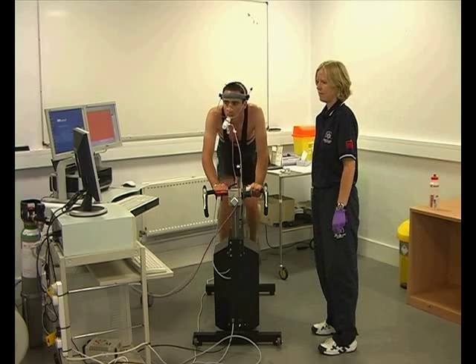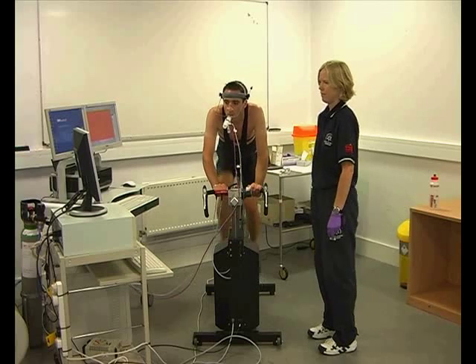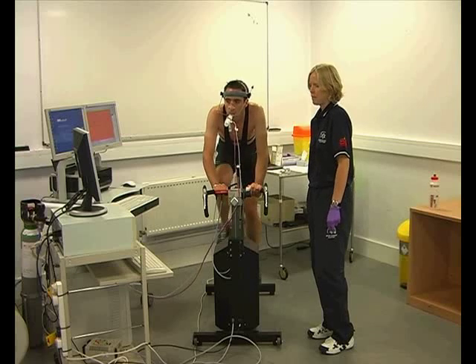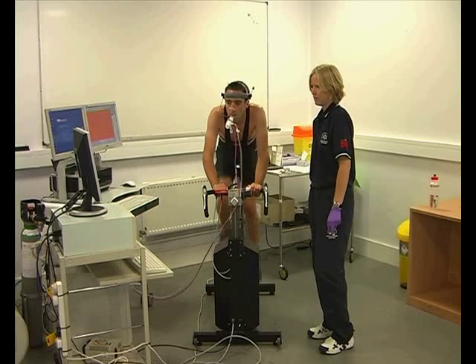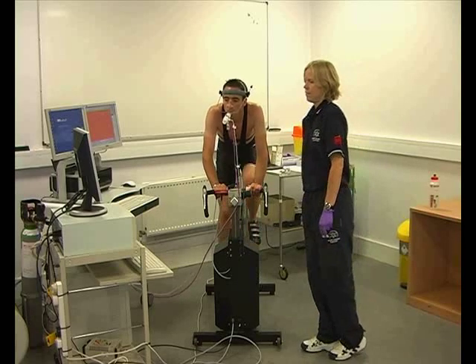So as you saw from the lactate threshold graph, we actually go quite a few points beyond the lactate threshold, typically up to about 80-85% of someone's maximum. That would equate to around about 10 mile time trial power. And the reason we do that is first of all to make sure we see the lactate threshold, but also to get an indication of the stress the athlete would be going through during their races. We found this is the best approach with our athletes to take, because it allows us to get all the data we need, and it doesn't actually take much out of them if they're going to do a subsequent VO2 max test.